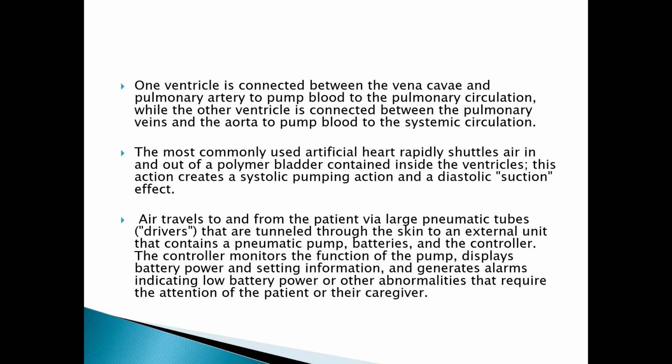Now, the controller monitors the function of this pump, and it displays the battery power and certain other information. It also helps to generate an alarm to indicate if the battery is low and other abnormalities that require the attention of the patient or caregiver.